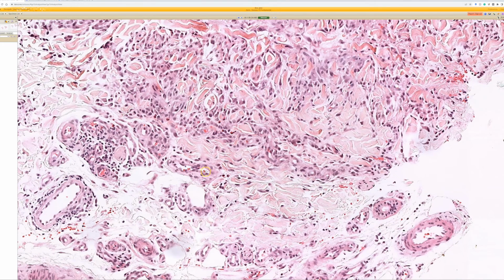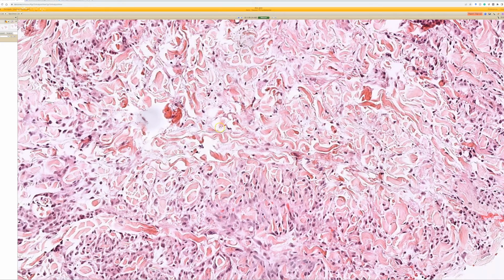All right. Another thing: I think early residents often struggle, and on cases they'll think of dermatofibroma in the differential with GA, and I think that's totally fair and reasonable, to recognize that those can look similar at the periphery. You just will not have a central zone of mucin in DFs.